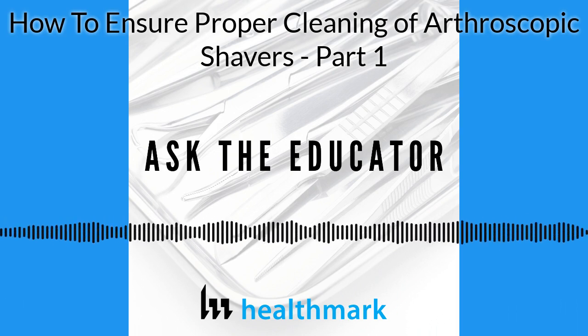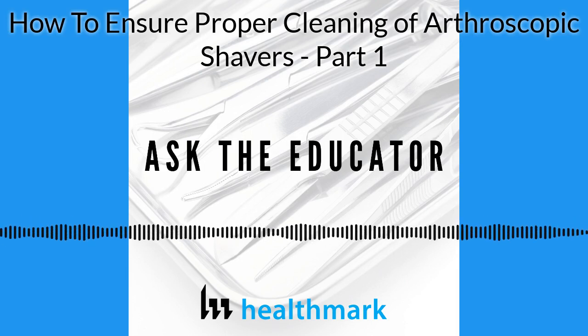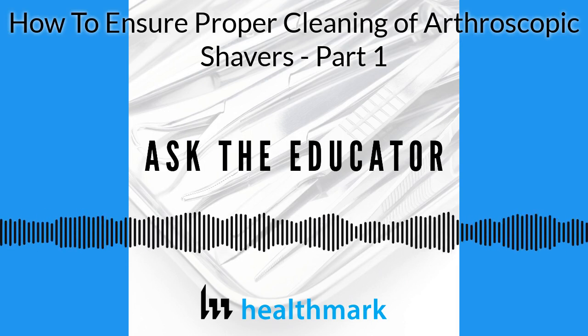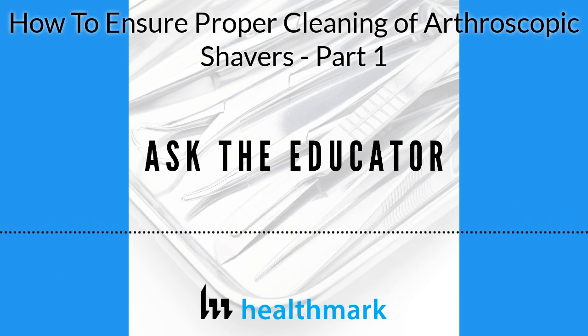Because one of the questions I've heard is, why isn't it mandated to have a borescope? Because people are looking for justification to purchase these items. But the reality is, if the IFU says you need to use it, then it is mandated.